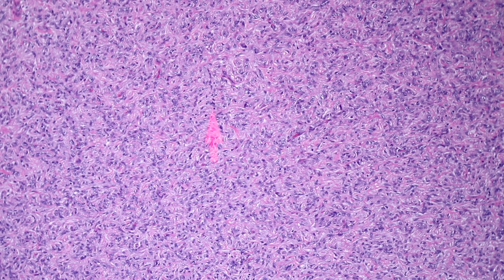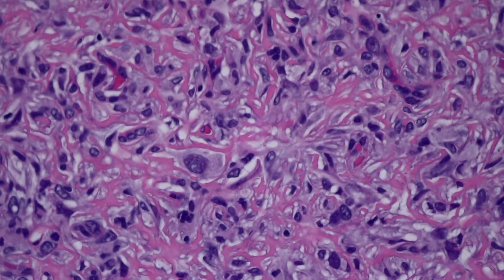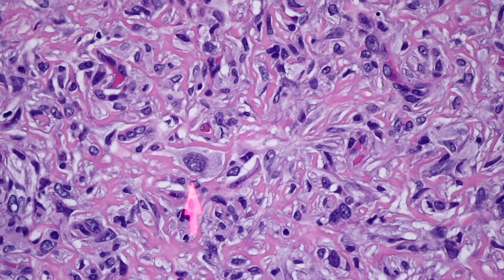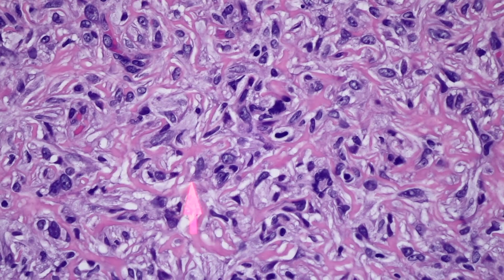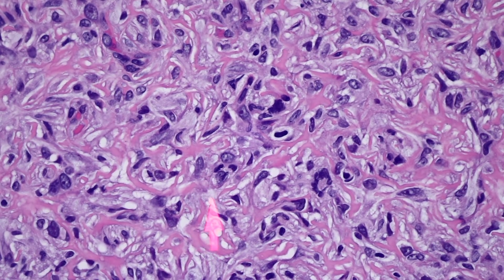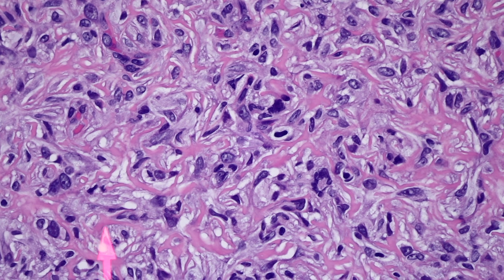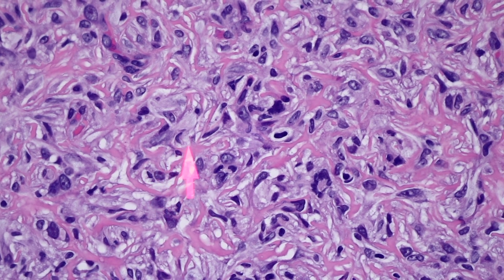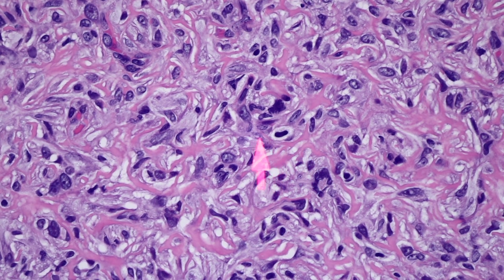Some people might call this a cellular Dermatofibroma because it is hypercellular, but I personally don't like to use that term for lesions like this - I prefer them to have intersecting fascicles of hypercellularity. Look over here - that's a huge nucleus, and if you just had that alone you might freak out, but in the context of the low-power view this is totally fine for a Dermatofibroma. Notice the background has a lot of dense pink collagen forming rings and arcs or arches, swirling in between the tumor cells.